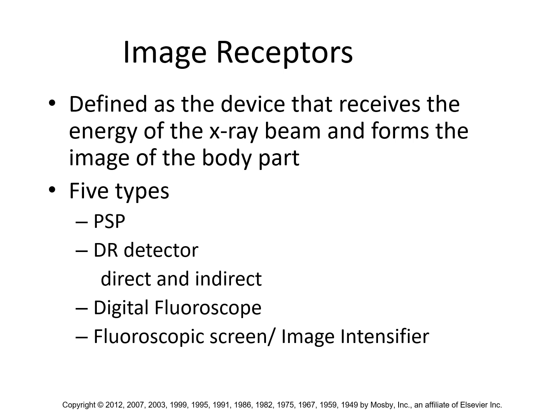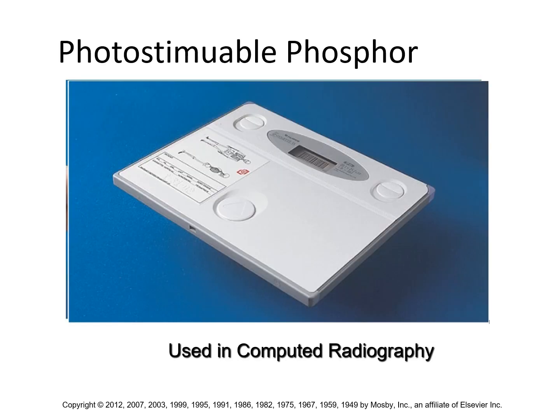Your older fluoroscopic technology, that would be your image intensifier. Okay, and I will teach you about how an image intensifier works at the beginning of your senior year. In fact, while you guys are learning this, the seniors will actually be learning the image intensifier in their imaging equipment class. All right, so here's our PSP cassette. It's still a cassette, and it still requires a second step in processing.